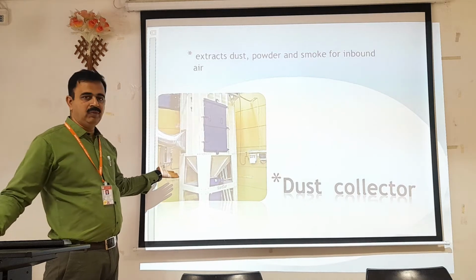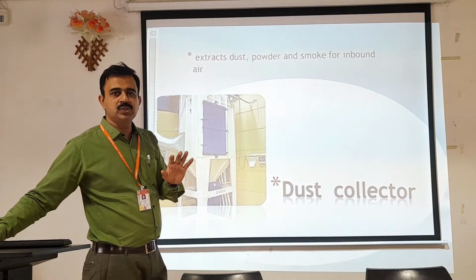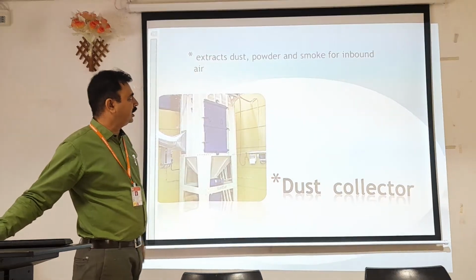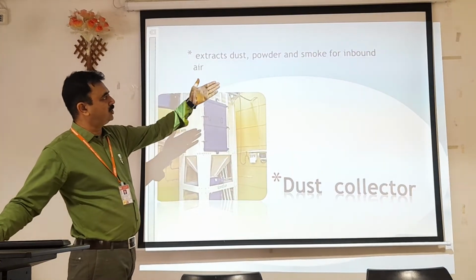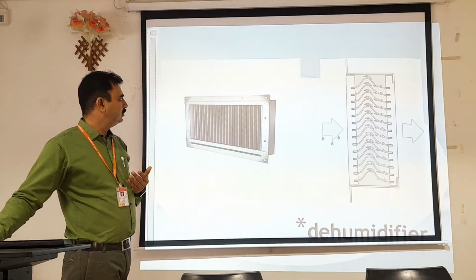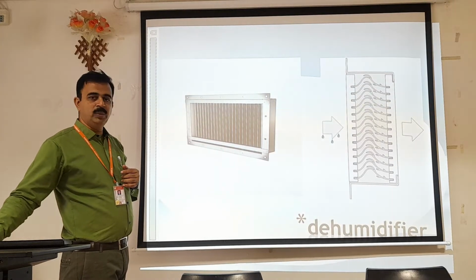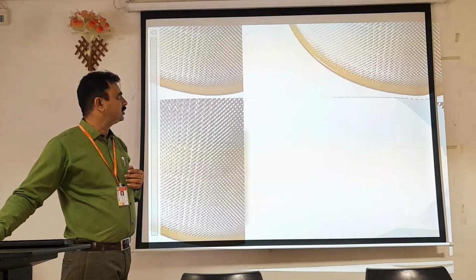Dust collectors are now available. Because operation theatres and microbiological units have to be very clean, such dust collectors can extract dust, powder and smoke from the inbound air, and the dust can be easily collected. Dehumidifiers can also reduce the level of humidity.